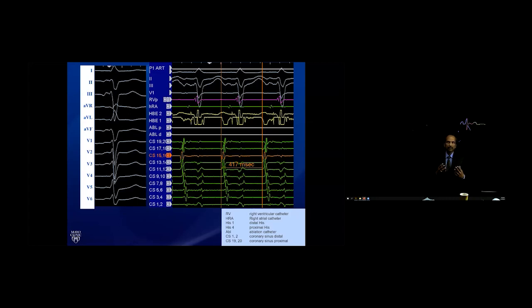If you're doing a case and you're not finding a great site, it's so tempting to just take your best shot. But you've got to tell yourself there's got to be the real location somewhere. And what can I do to try to maximize my chance of getting there? And it's that simple moment that you step back and say, I need to look further, that can really be the difference between success and failure.